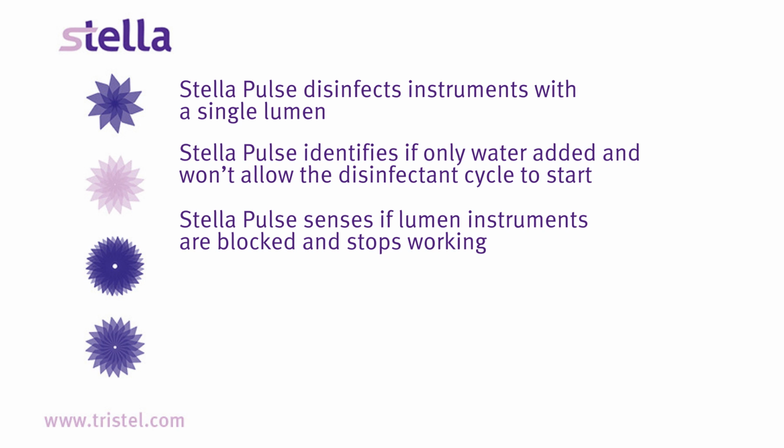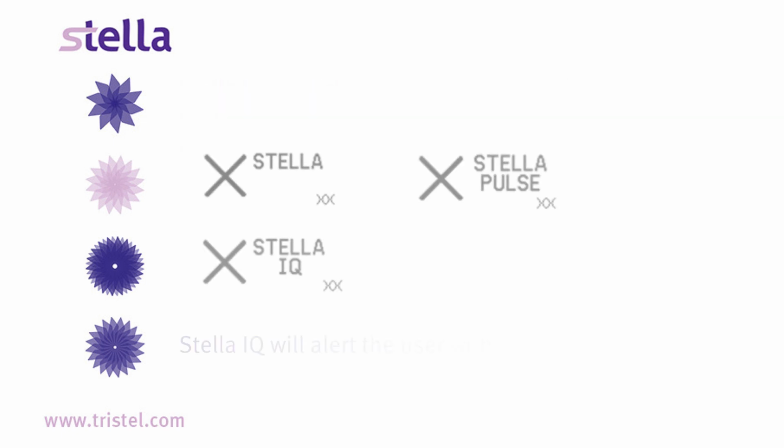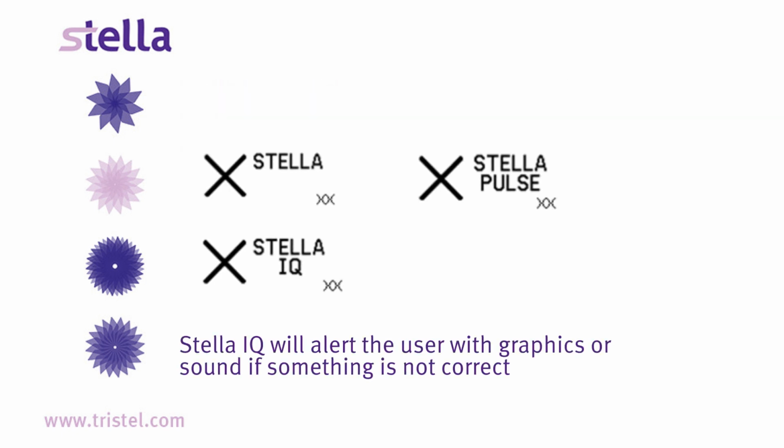If there is a blockage in the instrument, Stella stops working. If the instrument is not connected, Stella will not start the disinfection cycle. If the instrument becomes disconnected during the disinfection cycle, a validation code will not be given. Stella IQ will alert the user by graphics and sound if something is not correct.